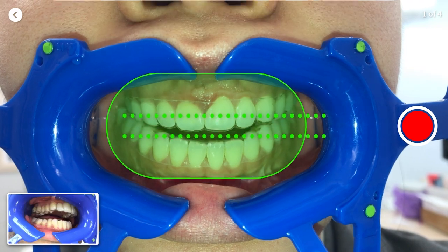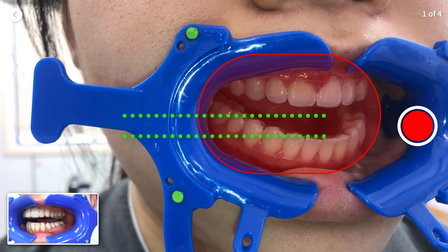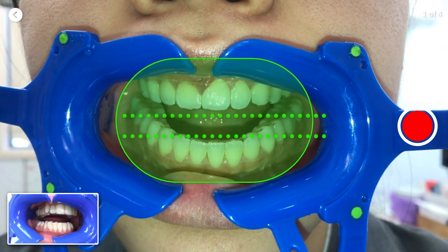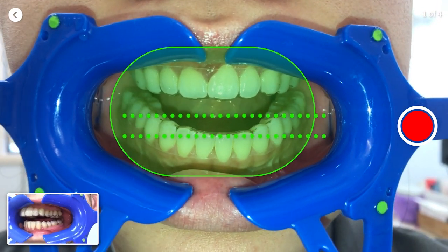Slightly open your mouth about finger size and align it with the green line. If not aligned properly, you'll see a red shaded oval indicating that you haven't aligned your teeth properly. When aligned, your flash should automatically turn on with a green shaded oval. Once you're ready, press the red button or the volume button to start the scan.